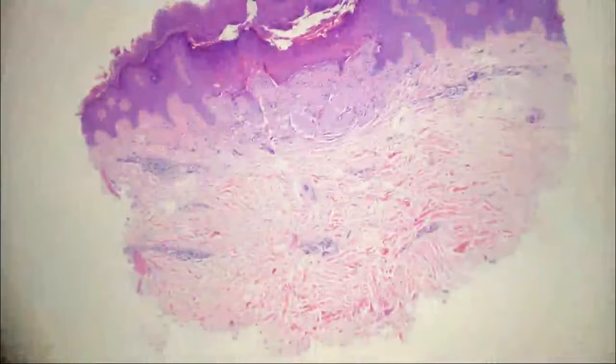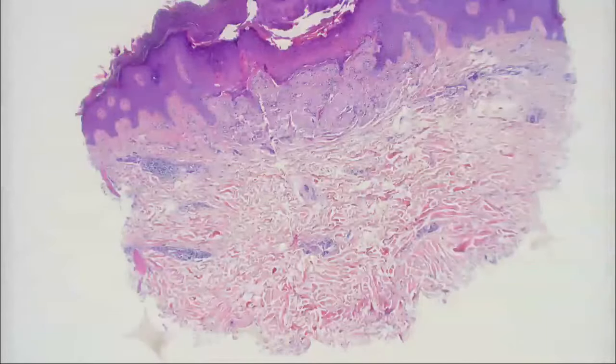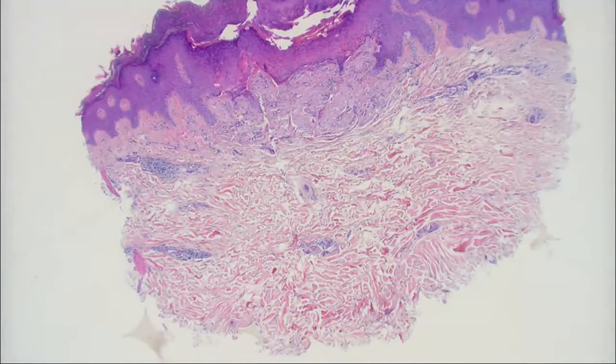We have a picture of it. It often occurs in the pretibial areas. Very itchy, it kind of gives you this rippled pattern. It's very characteristic of that. So this is lichen amyloidosis.